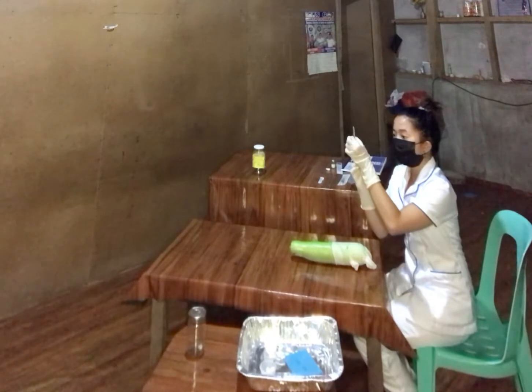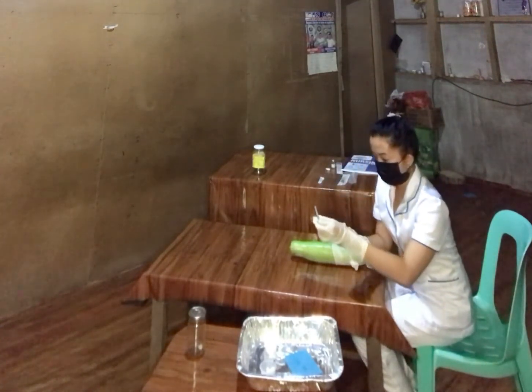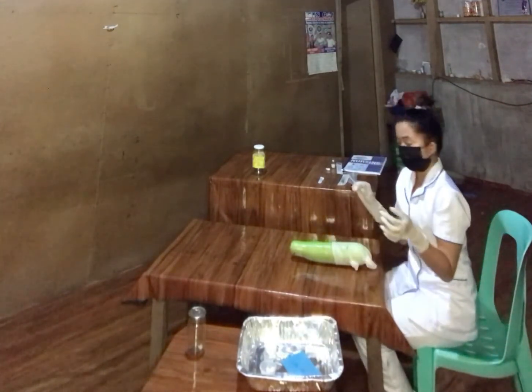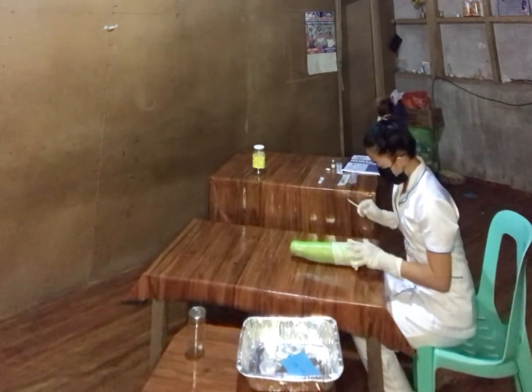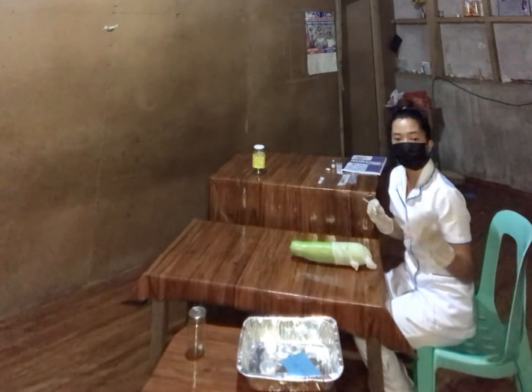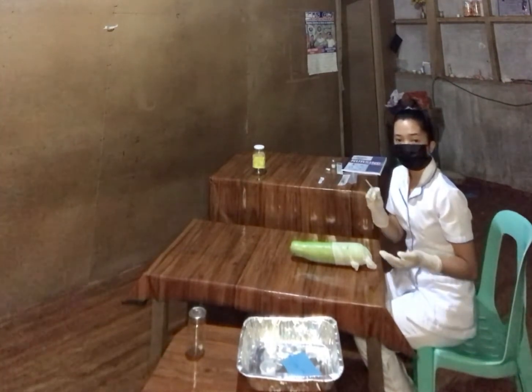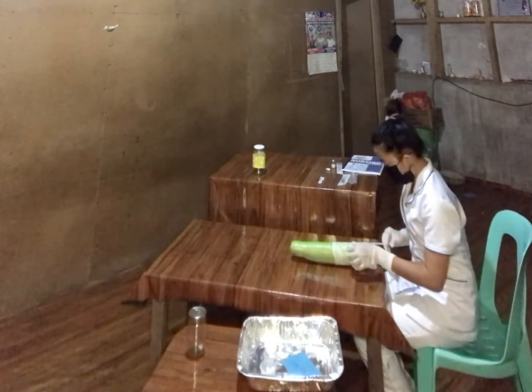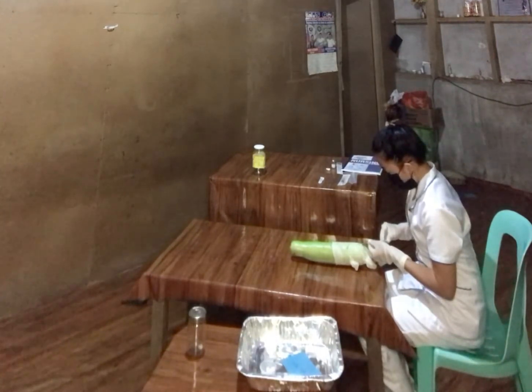So now I will put this. Check the skin tone. So I will check this. Pull the skin taut and bring the needle very close to the patient's skin. Insert it slowly at a 5 to 15 degree angle. So I will inject this, slowly injecting the medication. Let us inject this slowly.